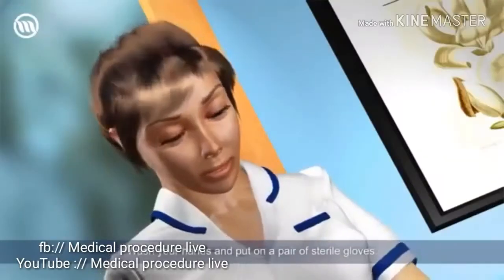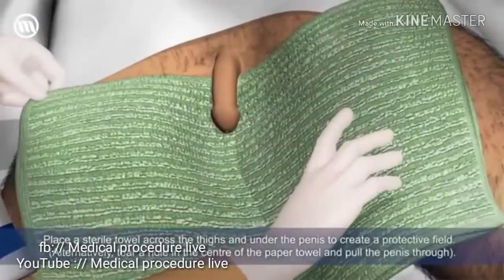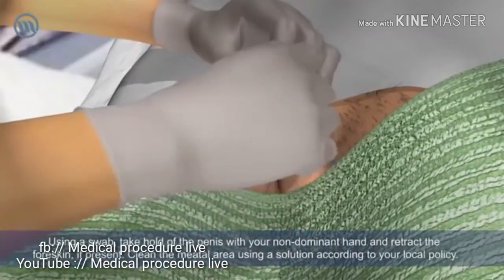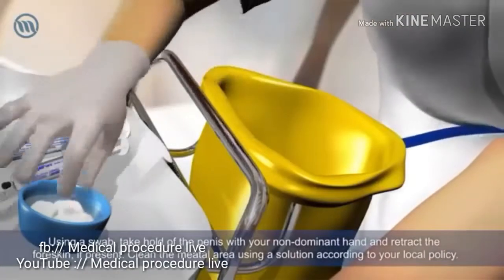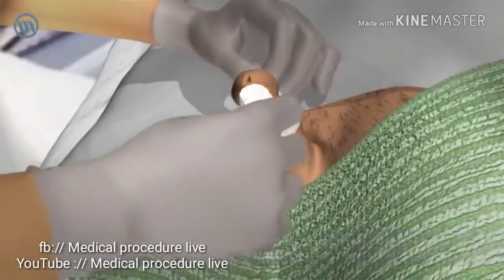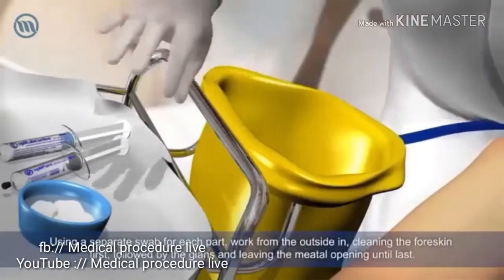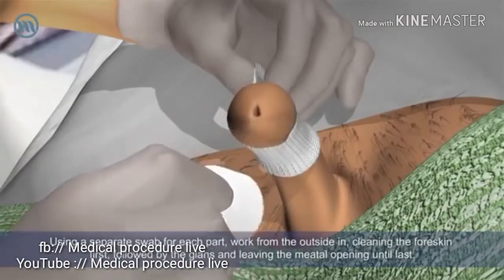Wash your hands and put on a pair of sterile gloves. Place a sterile towel across the thighs and under the penis to create a protective field. Alternatively, tear a hole in the center of the paper towel and pull the penis through. Using a swab, take hold of the penis with your non-dominant hand and retract the foreskin if present. Clean the meatal area using a solution according to your local policy. Using a separate swab for each part, work from the outside in, cleaning the foreskin first, followed by the glans, and leaving the meatal opening until last.